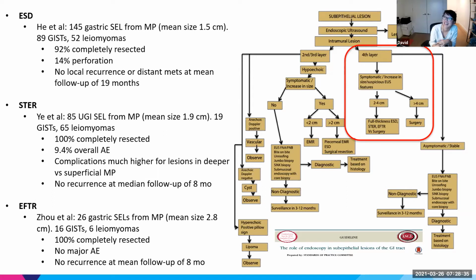I don't care what it is, get rid of it. And it's a wedge resection. It's not a gastric cancer. It's clearly subepithelial. So I commend the surgeons for just acting on this and not diddling around waiting for PATH and EUS and so on. So this is, I think, the right way this should be managed.